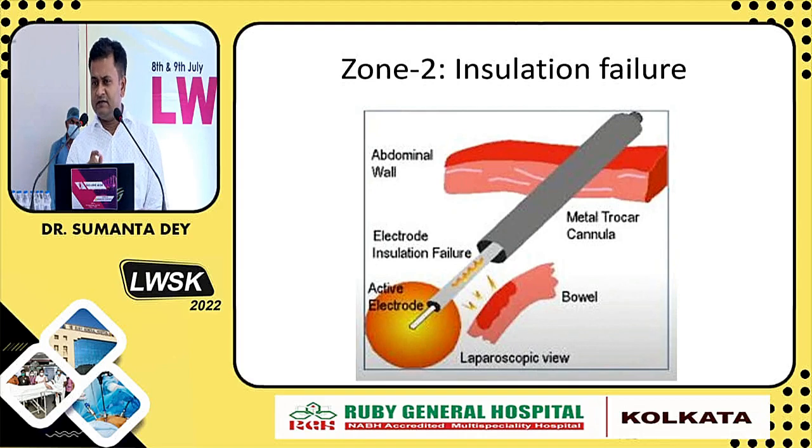Because if you are not continuously taking care of the instrument, over time there will be some kind of injury, and everything has a lifetime. At some point there will be a breach, and that may cost you more, because when you are trying to coagulate something with the tip of the instrument, if there is a breach in the insulation, the energy can directly jump from that instrument into the nearby bowel, and it can cause severe bowel injury and a post-operative complication. No patient can expect that while doing laparoscopic cholecystectomy they develop a fecal fistula or peritonitis. So that should be taken care of.